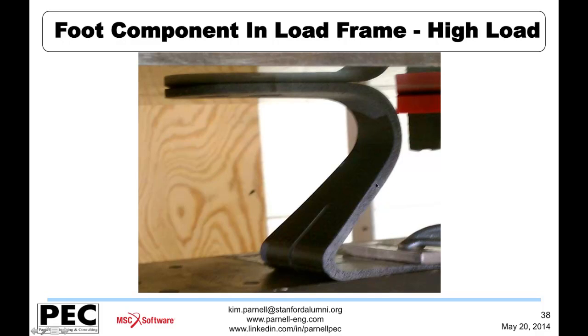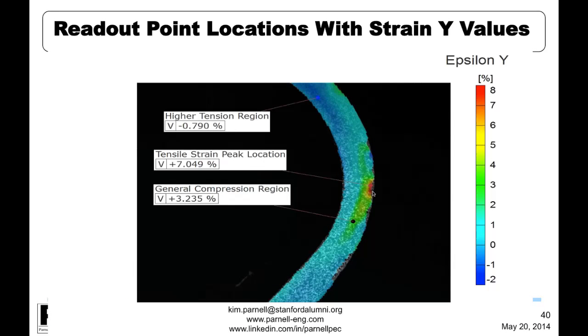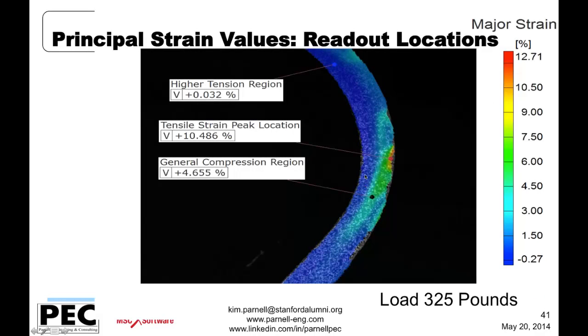Here you'll see this heel component with basically white speckled drops, paint droplets on here that will be used as the tracking points by the software. So you get a rather fine pattern of dots, and with good resolution on the cameras, you can ultimately compute good, well-resolved fields through the thickness zone. And here's some of the aspects of what you can see in terms of principal strain values as you go through the thickness of the components. Here's a principal strain value, and this contour plot of principal strains as you go through.